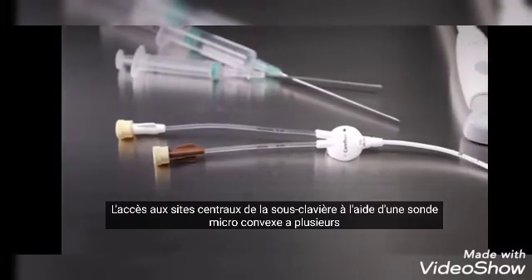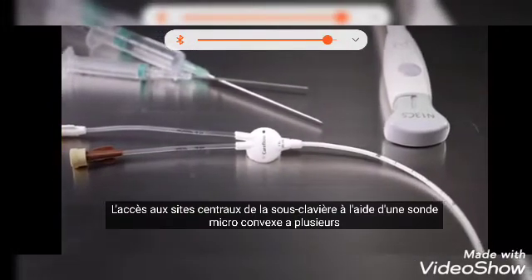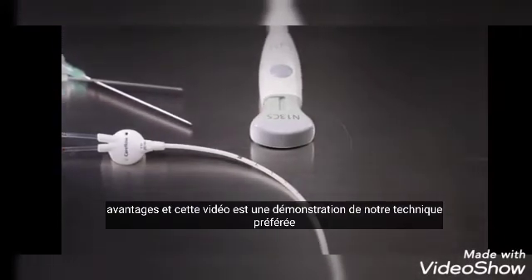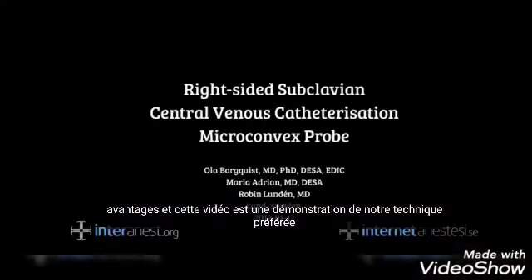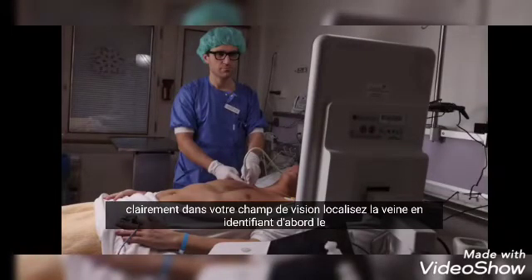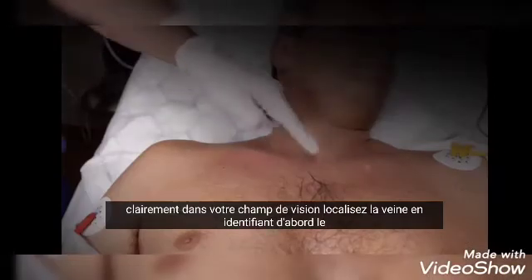Using a micro convex probe has several advantages, and this video is a demonstration of our preferred technique. Be sure to have a comfortable working position with the ultrasound machine clearly within your line of sight.